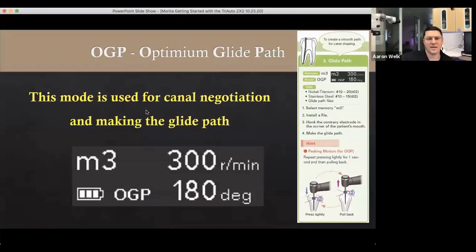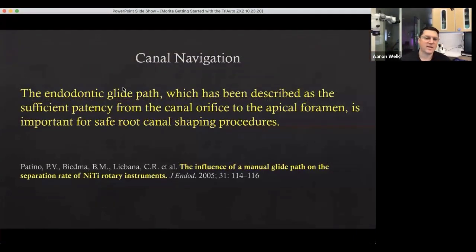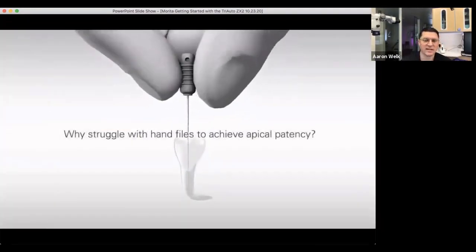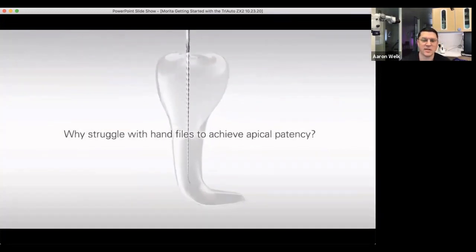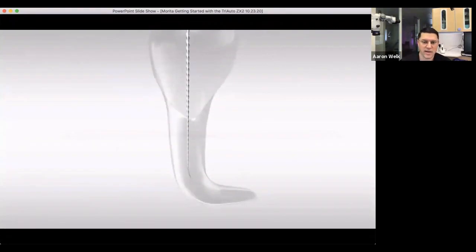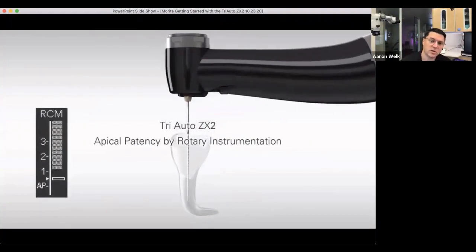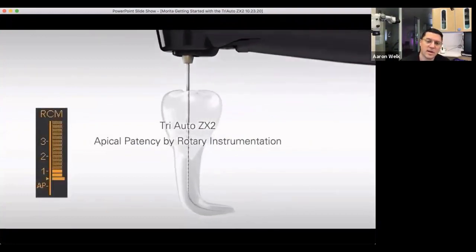The next mode is the Optimum Glide Path. With M3, you use this to navigate the canal system. M4 is canal shaping; M3 is glide path. Glide path is basically having patency from the canal orifice to the apical foramen — if you've created a glide path, your rotary instruments will follow. With the Triada ZX, this glide path technology is incorporated into the handpiece, similar to the watch-winding balanced force technique.